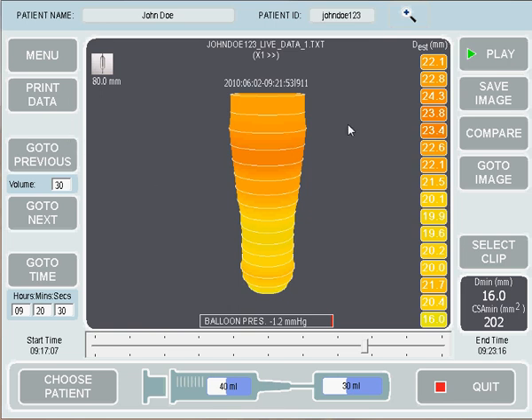If I wanted to print out the current image or one of the snapshots from earlier, we can press the Print Data button, which will allow us to print to our printer or to print to a JPEG image so that you can copy and paste the image into Microsoft Word or a similar package.